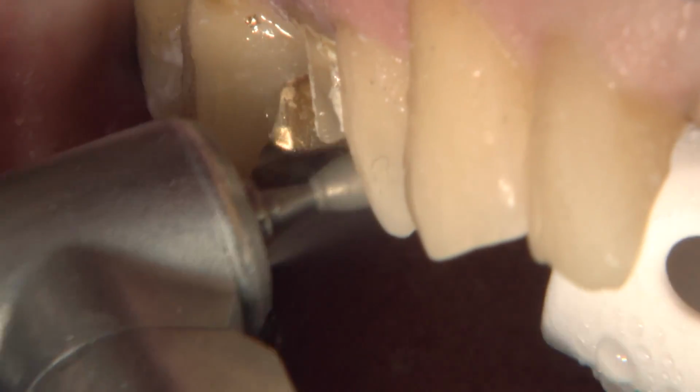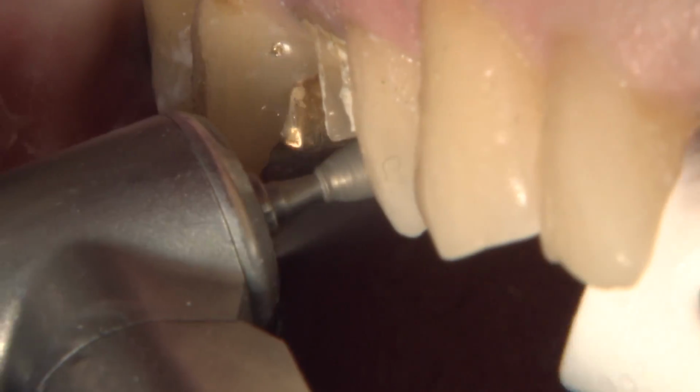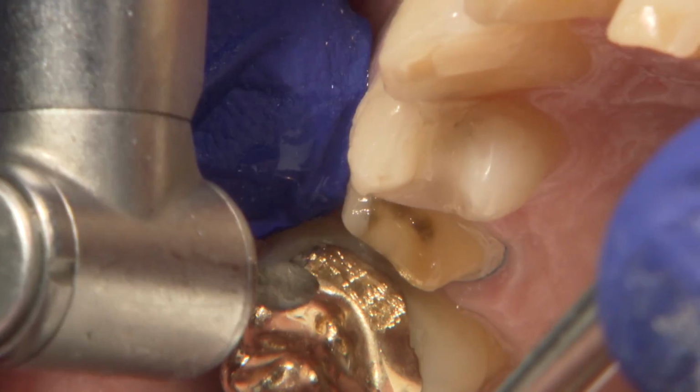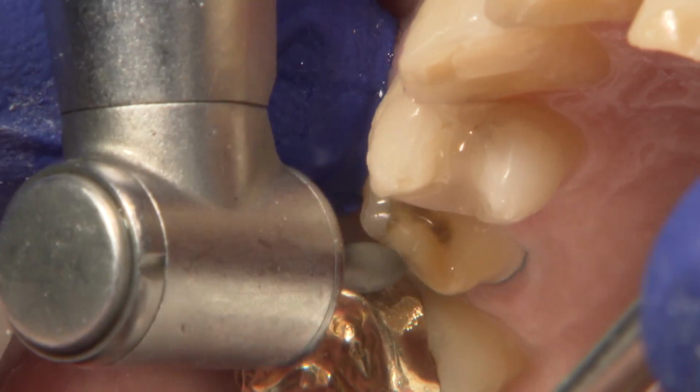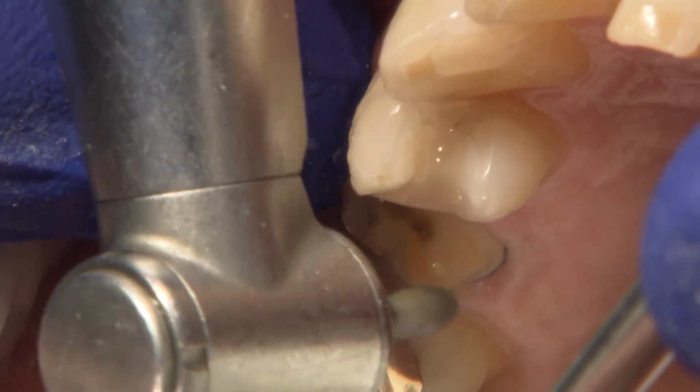On number 4, I will refine the preparation a little bit from the original prep, reducing the occlusal a little bit more to about 1.5 millimeters of reduction, and also rounding those internal angles, also using a football diamond.